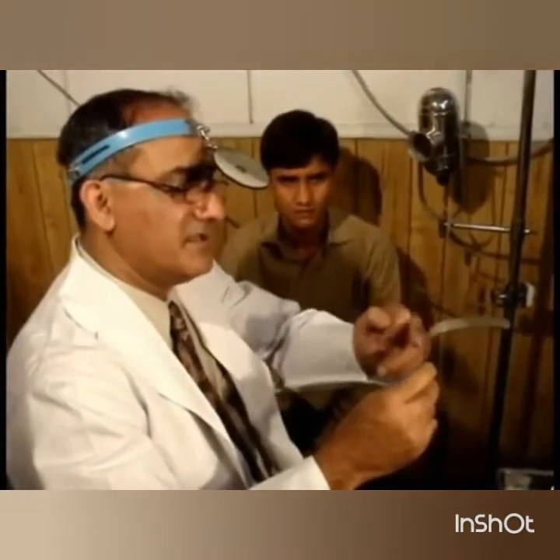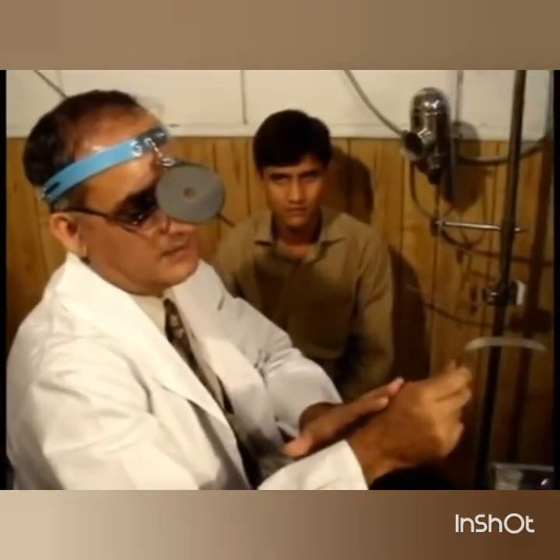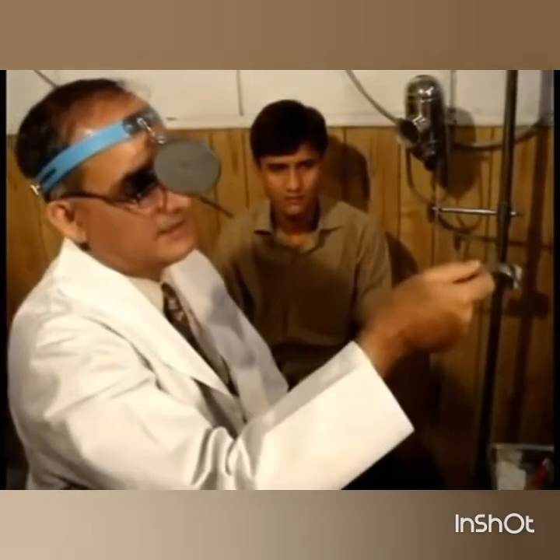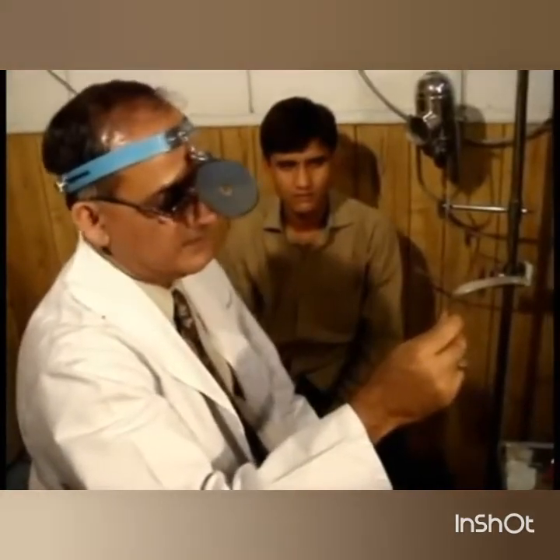The tongue depressor has got this curve so that when we are putting the tongue depressor on the tongue, the hand is not in our way. We can see the oral cavity clearly. If it is straight, then the hand is coming in our way. This way, the hand is not coming in the way of the examination.